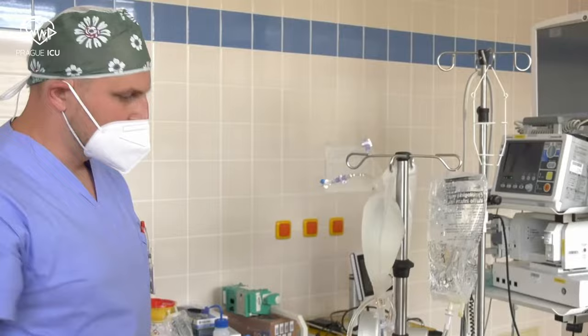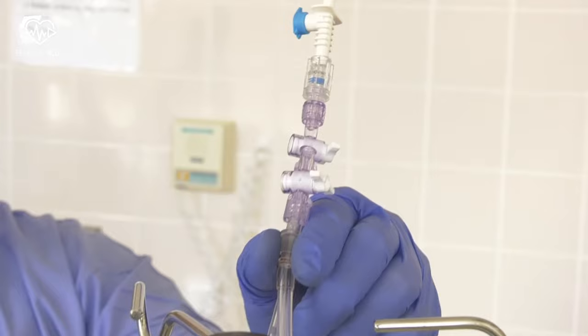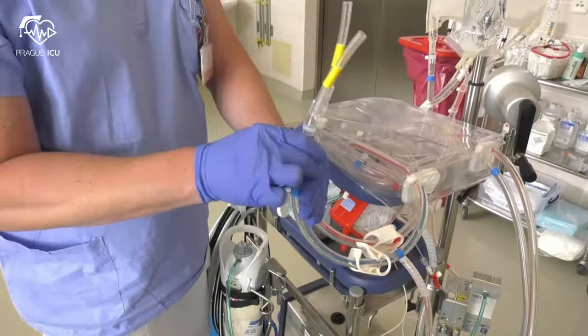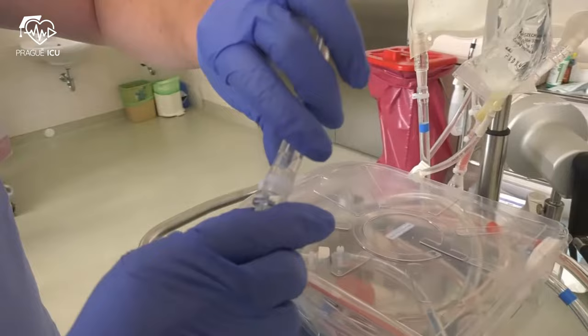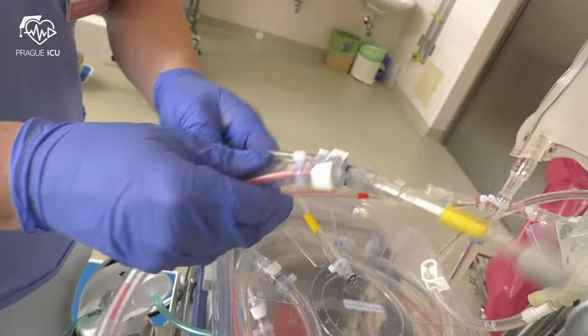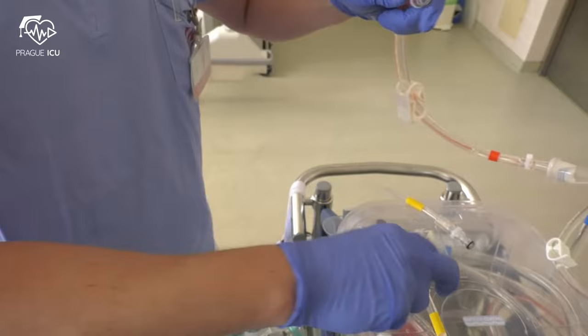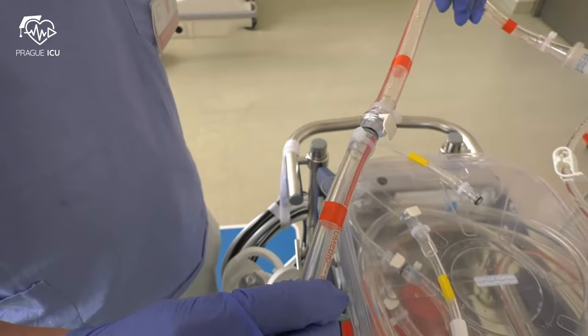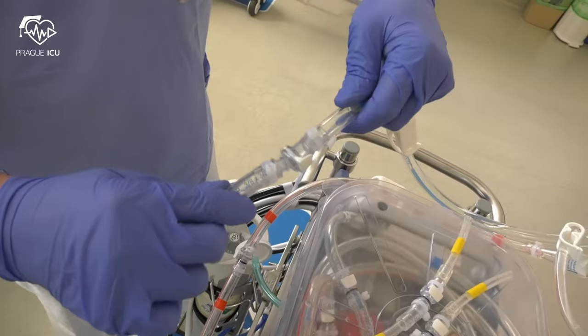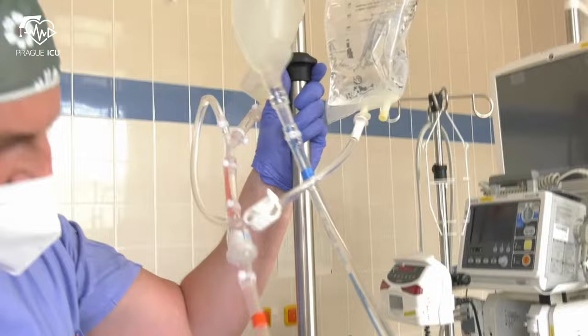Close the clamp on the priming line and close the line after the de-airing. Open the connections and connect the red line of the priming bag to the red line of the set. Make sure all clamps on the red line are open. Continue with the connection of the blue line of the priming bag to the blue line of the set. Make sure that the clamp on the priming set is closed.